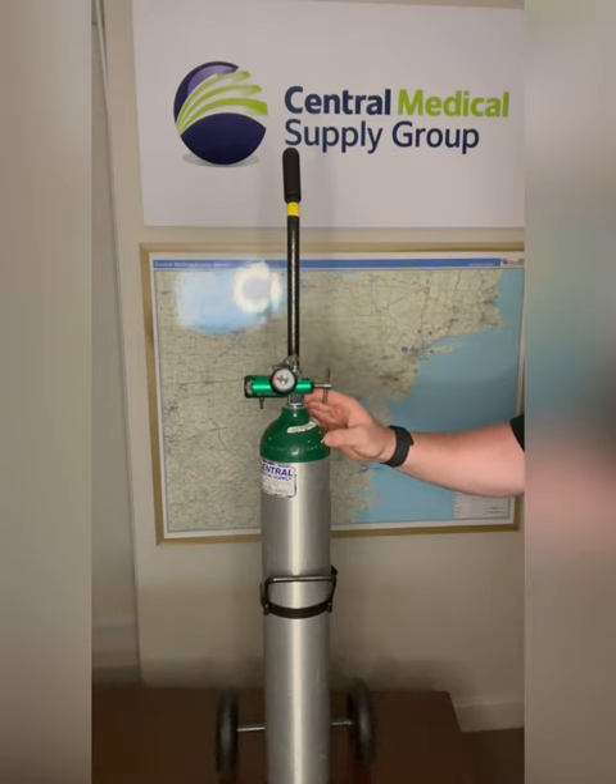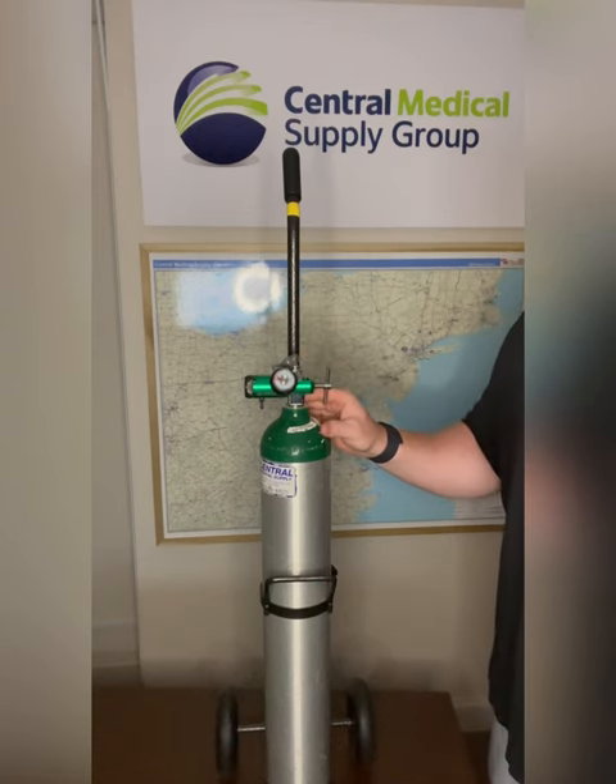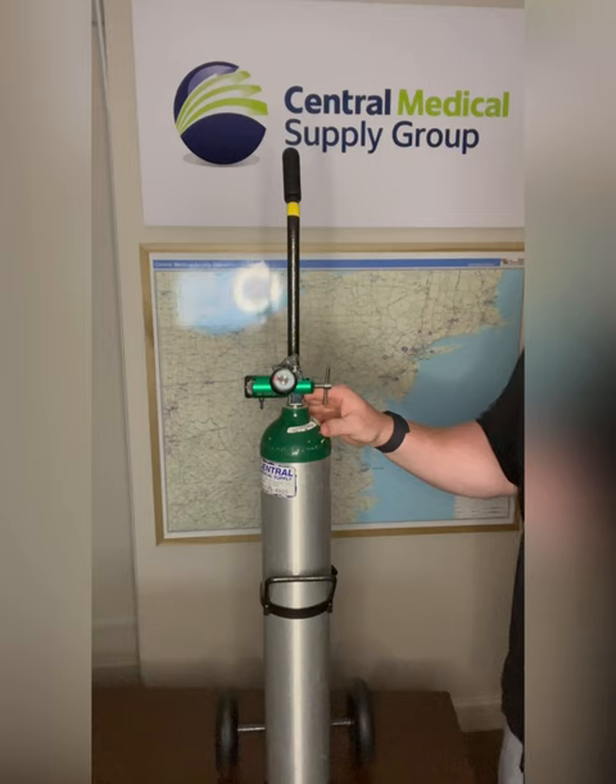Our backup E-tanks, when full, will provide about five and a half hours of oxygen at two liters per minute, three and a half hours of oxygen at three liters per minute, and two and a half hours at four liters per minute.